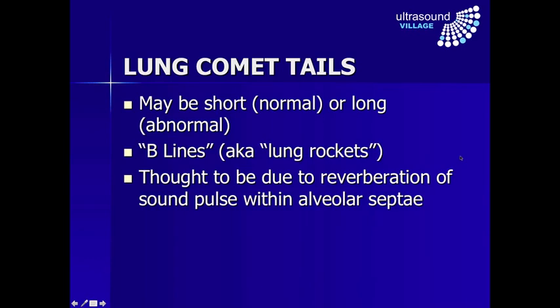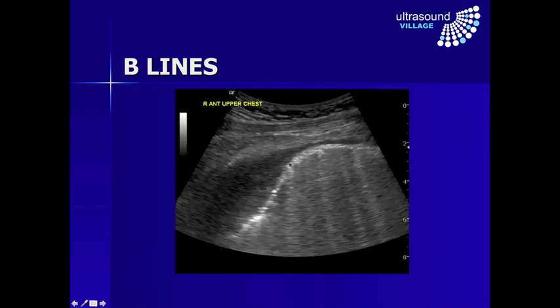In lung ultrasound, comet tail artifacts may be short — very similar to those in the gallbladder — and are quite normal with no significance. Or they may be long, going through the entire depth of the screen, in which case they are referred to as B-lines, also sometimes known as lung rockets. In lung, this is thought to be due to reverberation of the sound pulse within the alveolar septa. Here is an example from a lung — this is the pleural surface right up near the top of the chest, and here we have these reverberation artifacts running down all the way to the edge of the screen.